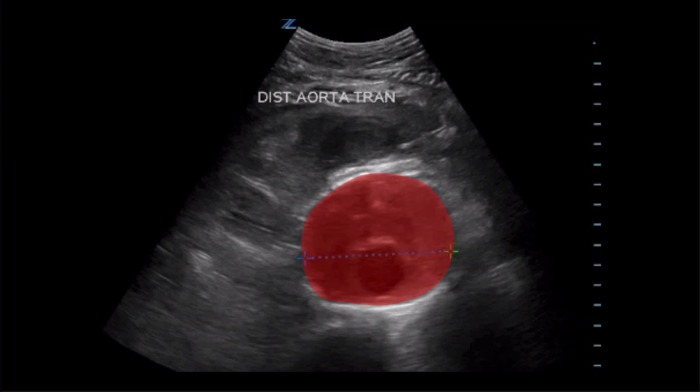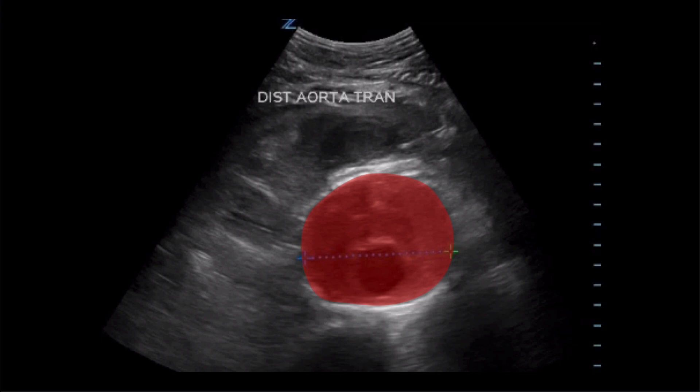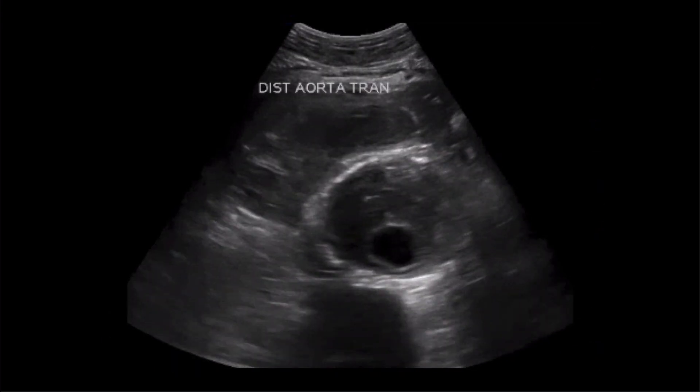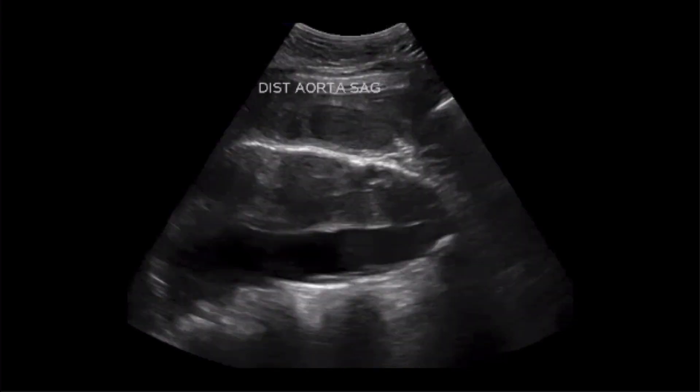This highlight represents the entire aorta in cross-section, which the physicians astutely identified and measured with the machine calipers. This aneurysmal dilation was approximately 8 centimeters, well beyond the 3 centimeter upper limit of normal. It is very important to differentiate the two, since one would lead you to the diagnosis and the other to a false sense of reassurance.